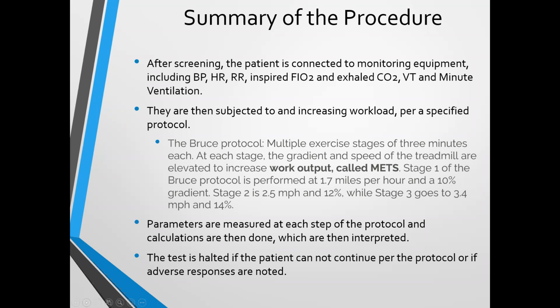Parameters are measured at each step of the protocol, and calculations are done. They're actually done by the computer, so it's not like you sit there with a pen and paper anymore. The test is halted if the patient cannot continue. And again, there's adverse response, but there are several indicators that patients are checked for. And if those were to manifest themselves, the test would be halted. The clinicians would stay with the patient, administer oxygen, administer rescue medications, things along those lines.